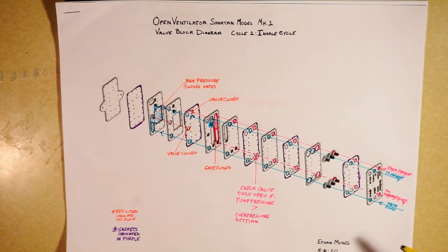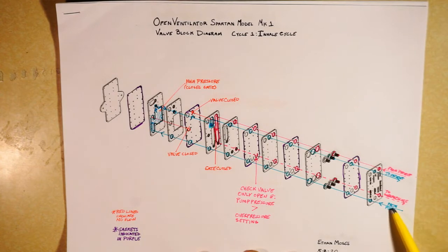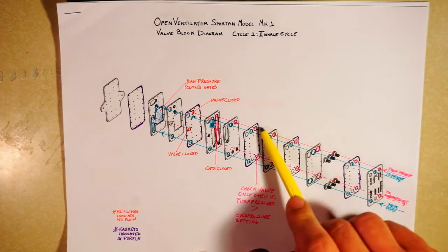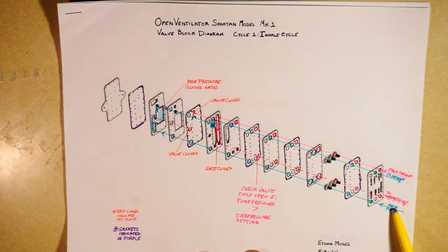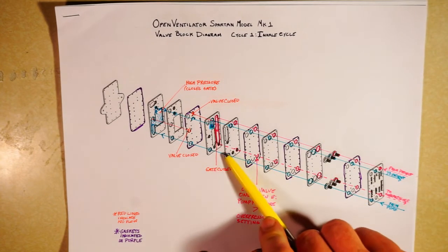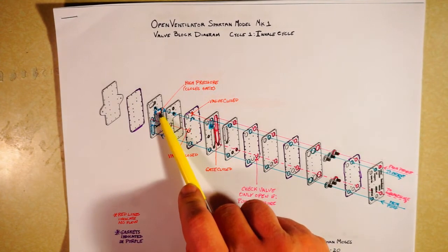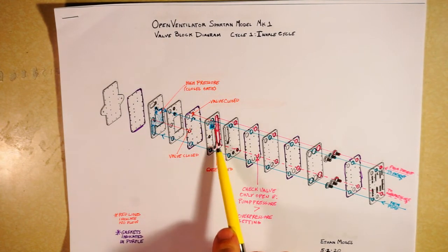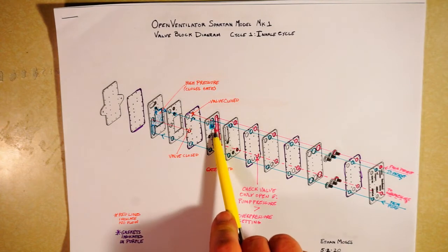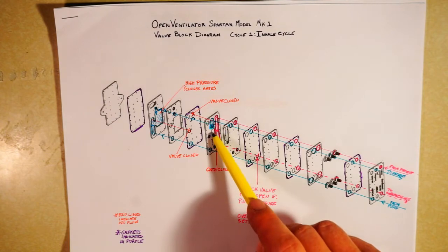Okay, so during the inhale cycle, the pump is compressing and pushing air through from the pump port. Again, these are just mounting blocks for these nozzles, so we can kind of ignore them. But the pump is pushing air in through these ports and into the top of the pressure gate valve. That pressure then pushes down on this membrane, helping to seal this line between the patient pressure chamber and the PEEP chamber.